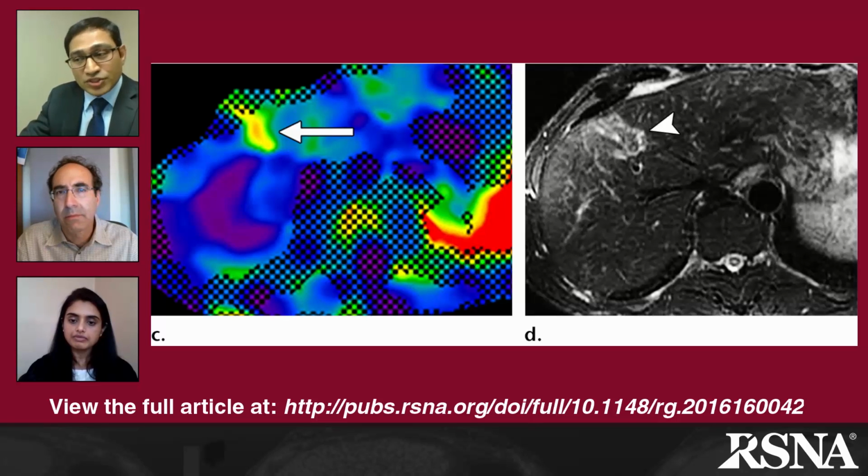Right now, primary sclerosing cholangitis does not have a treatment. In the future, if a treatment becomes available, we can show these changes occurring with the treatment, and this will be helpful. And these changes are very focal. They won't occur globally in the early part of the disease. And you can see these kinds of changes also in autoimmune hepatitis, in which you have rings of hyperplastic nodules surrounded by stiffness or fibrotic nodules. So all these changes can occur, and these changes can be very subtle and distributed throughout the liver.